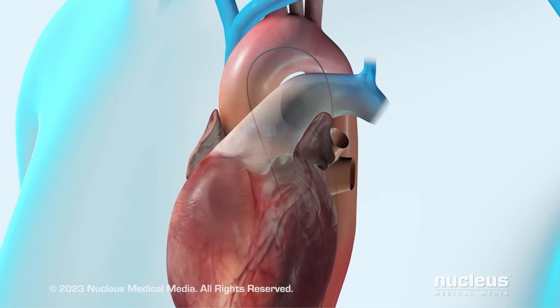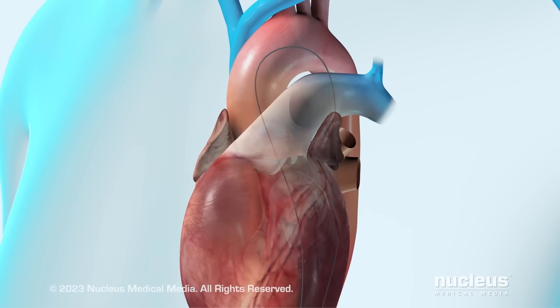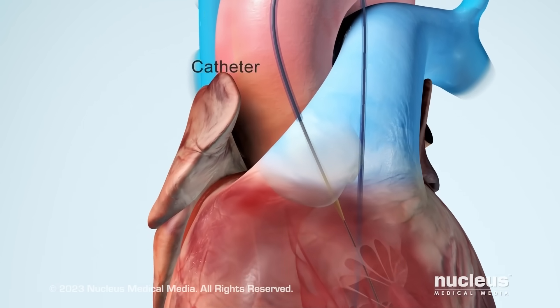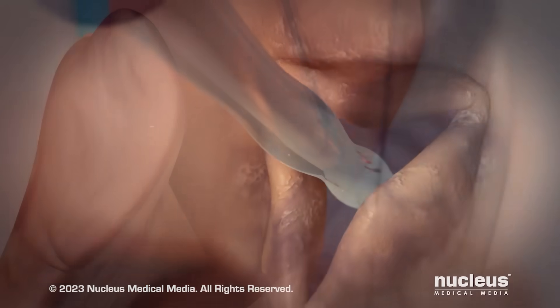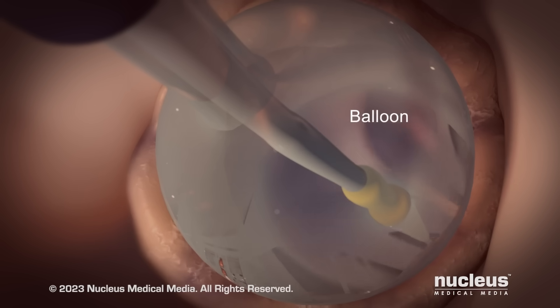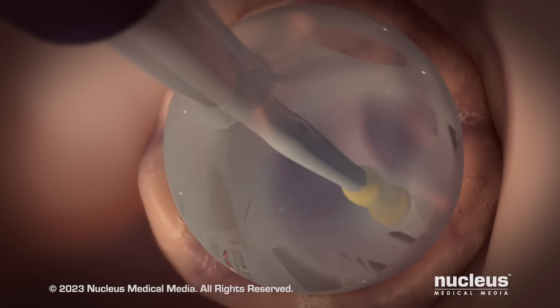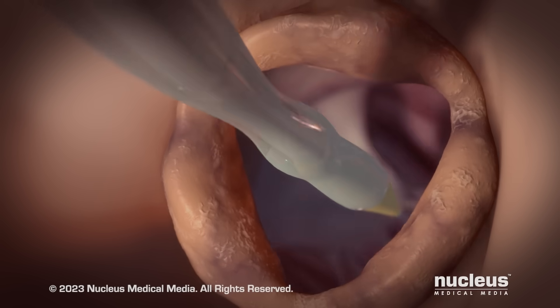Then the guide wire will be pushed through the opening in your aortic valve and into your left ventricle. Your doctor will use the guide wire to pass a flexible tube, called a catheter, through your aortic valve. A balloon on the tip of the catheter will be inflated to widen the opening in your aortic valve and push the valve leaflets to the sides. After deflating the balloon, your doctor will remove the catheter.